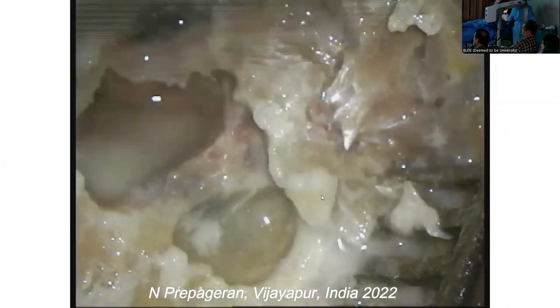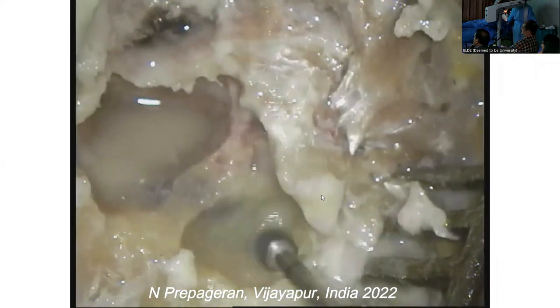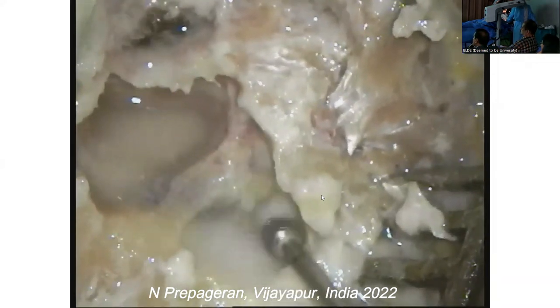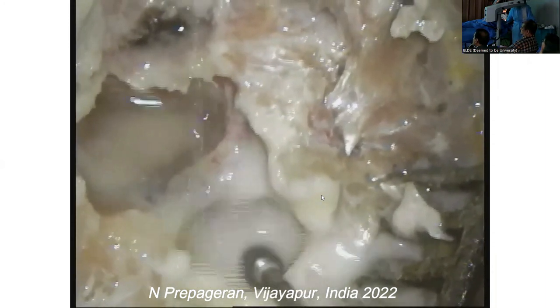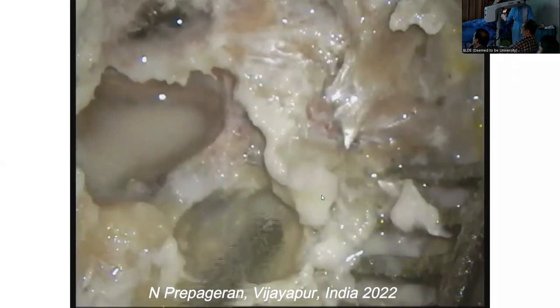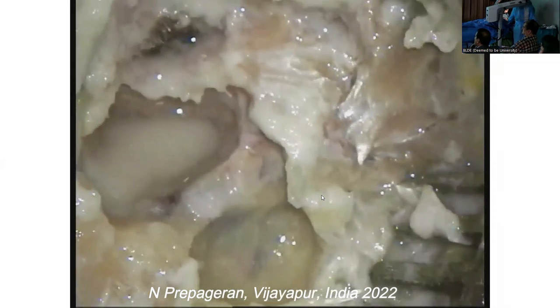And you can see how fast we're doing it. So if we can do it this fast with a small diamond and a long burr, can you imagine how fast we will do it in real life when we have sharp, large burrs and a stylus drill? You guys? That's dura. Can you see? Let me show you. It's actually bleeding, huh? The emissary vein. So that's your sigmoid there.